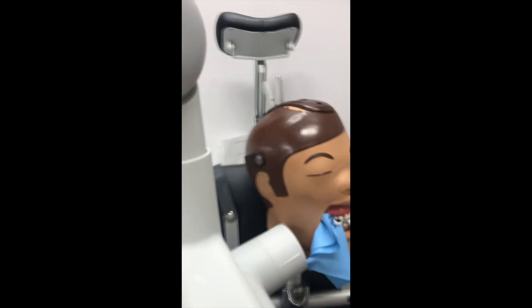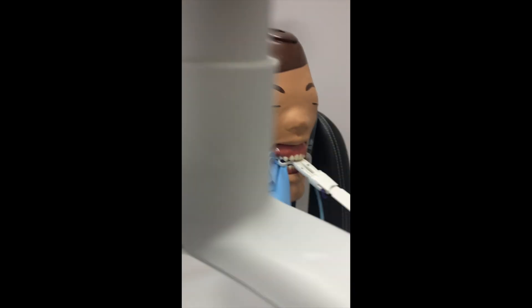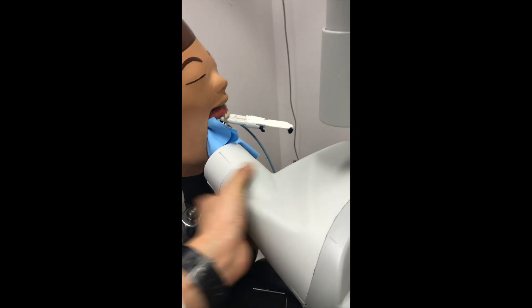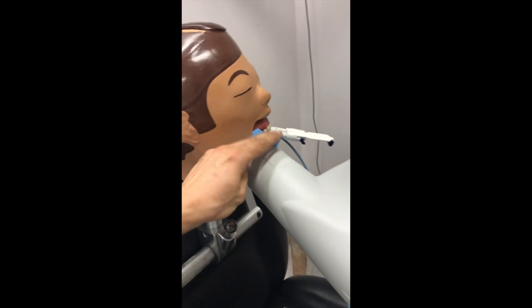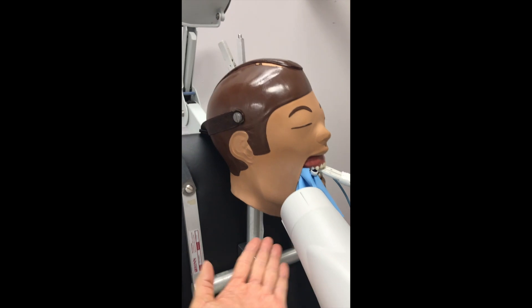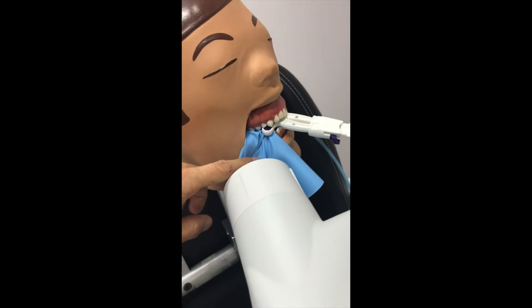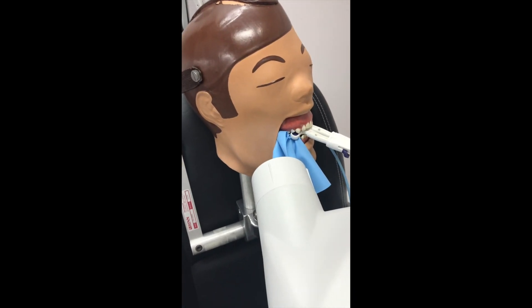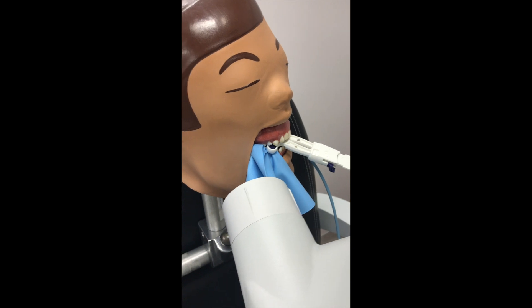This definitely takes practice to get the right angle. If you want a mesial shot, you can come in like this with a good angle — come up at an angle from below — and that's how we get a mesial shift shot, using the SLOB rule to figure out which file is what.